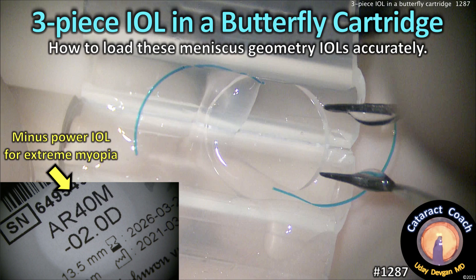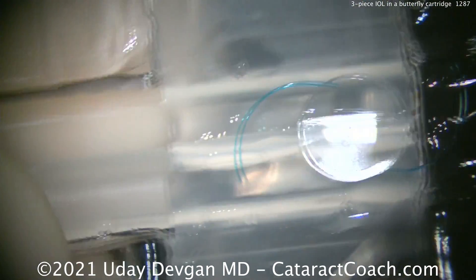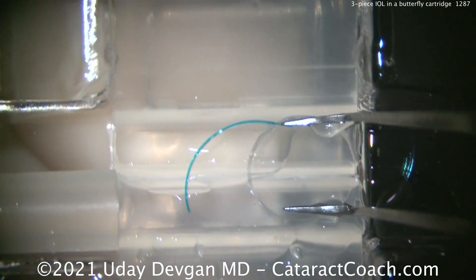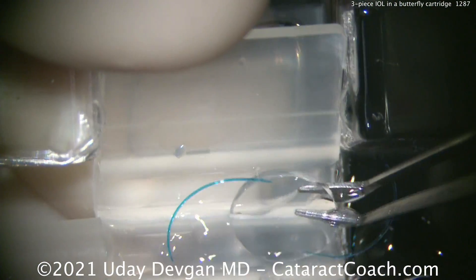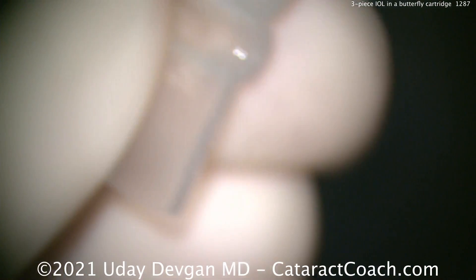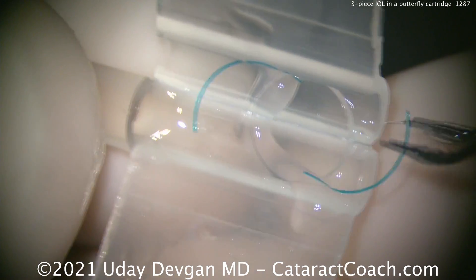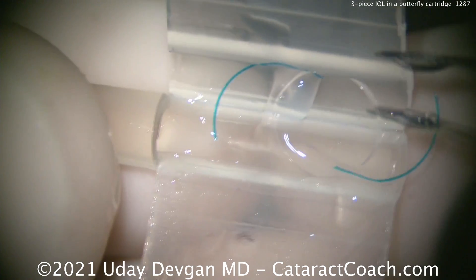CataractCoach.com: three-piece IOL and a butterfly cartridge — how to load these meniscus geometry IOLs accurately. Here's the cartridge filled with viscoelastic and the three-piece lens. Rather than pushing down and trying to get under those edges, there's an easier way: slide it underneath these lips just like that, and see how it's locked in. That way you don't damage the optic.